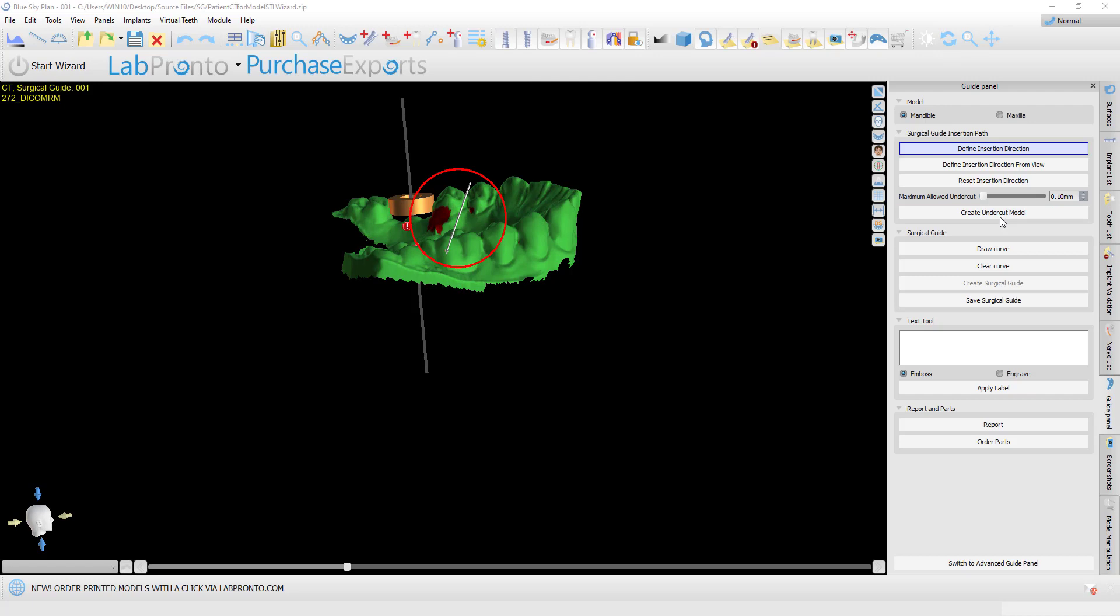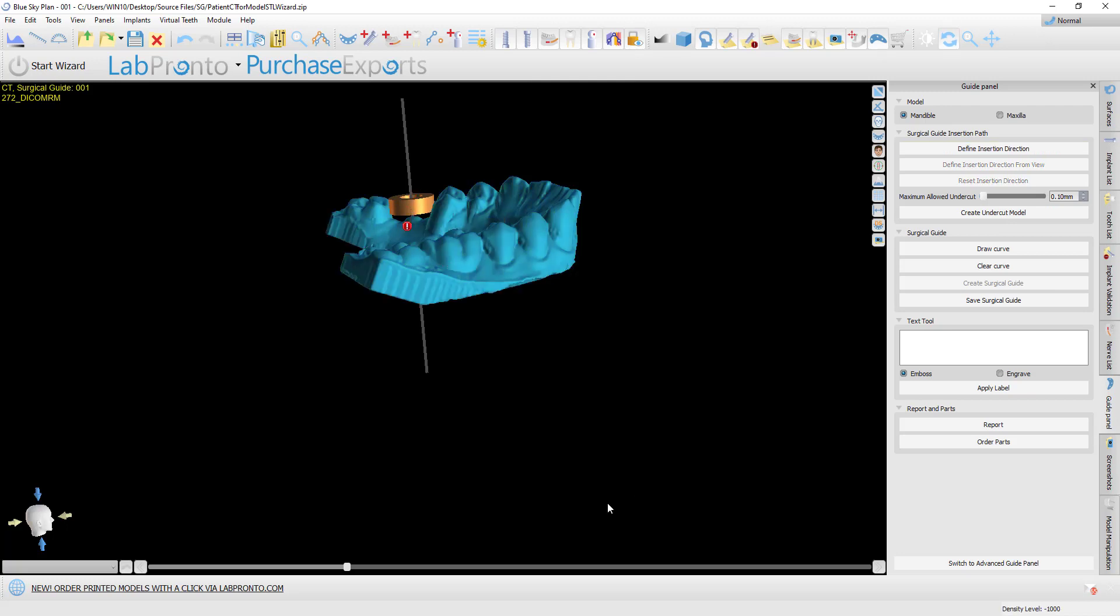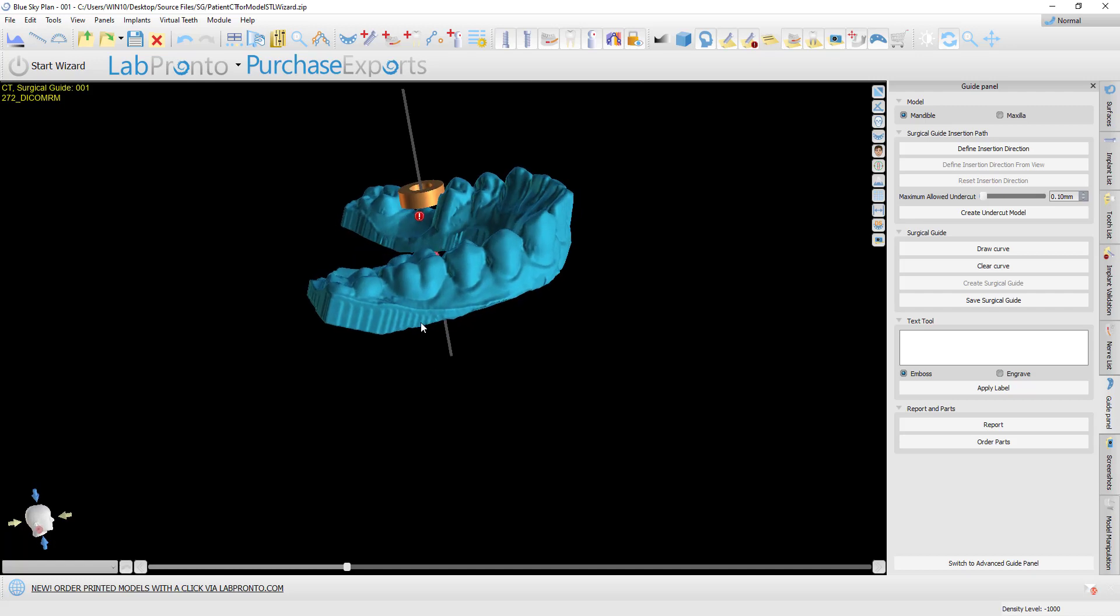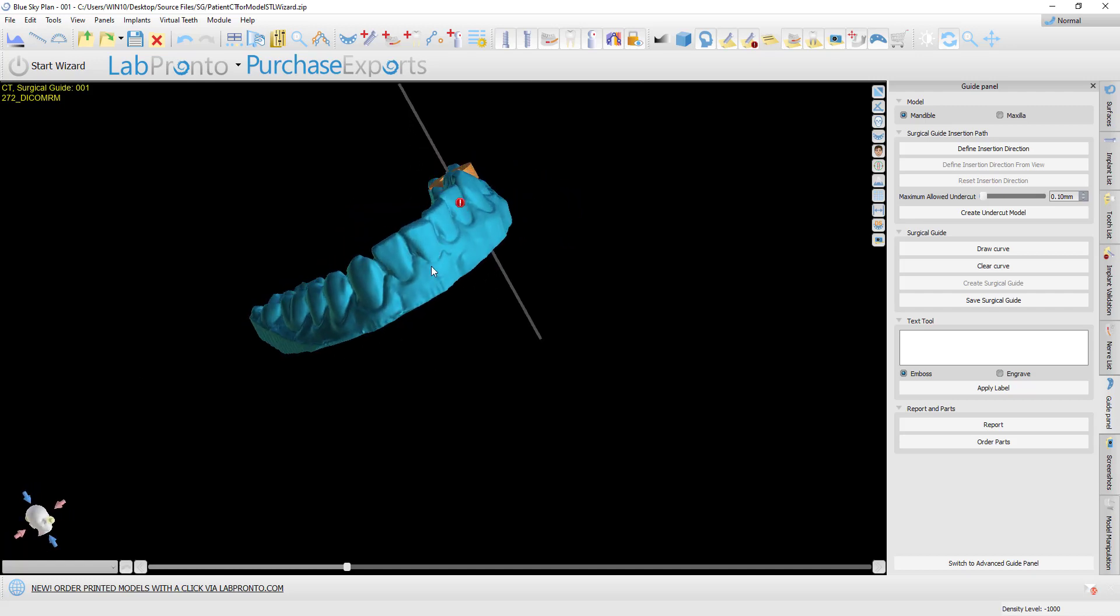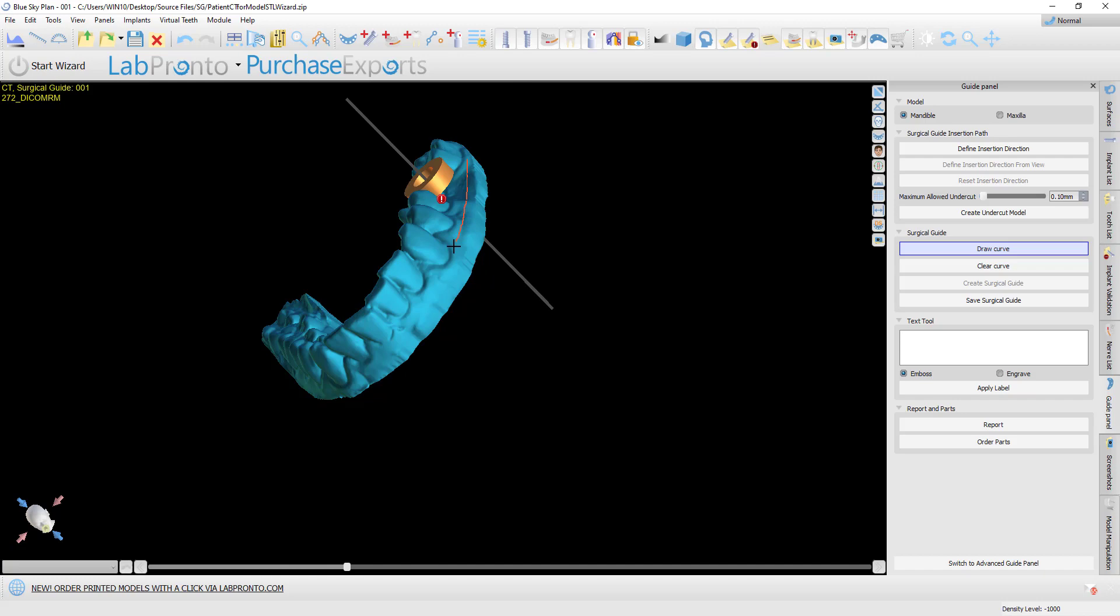Once we click 'create undercut model,' the software creates the model with the undercuts removed. It's visible by default on the screen, and we can click 'draw curve' to start drawing the surgical guide curve.